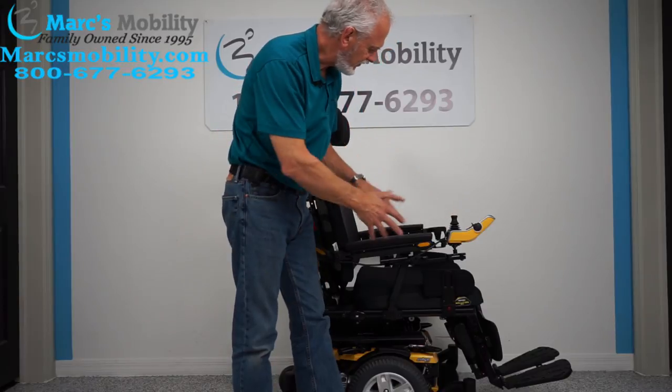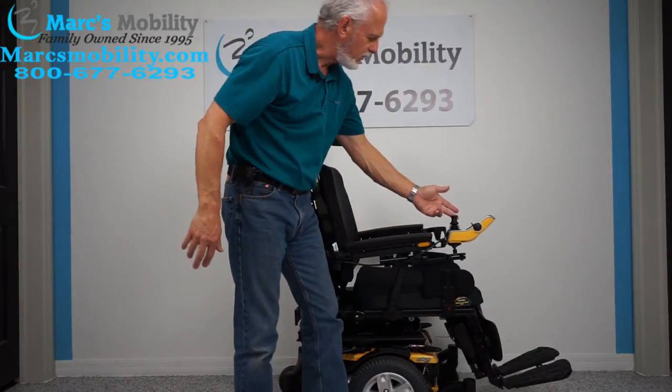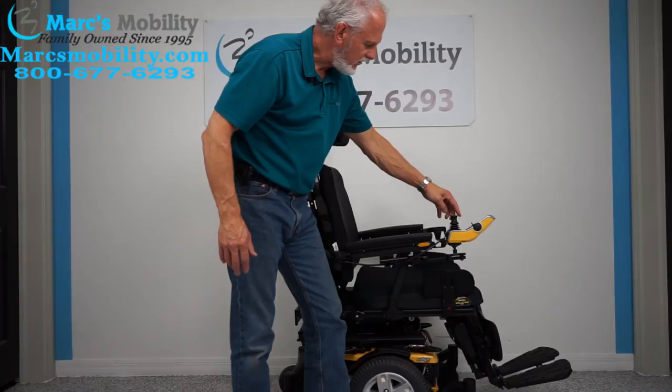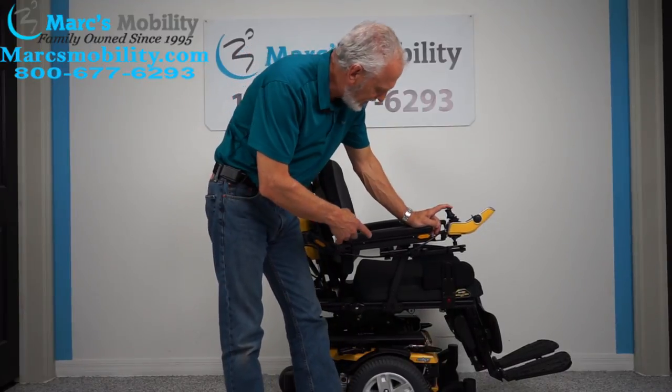Whatever is yellow on your seat is what the function is going to be working. Right now with the bottom and the back yellow, that would be tilt — but I'm going to move it sideways until I get the bottom of the seat yellow by itself. Once that portion is yellow, pull the joystick back, and here goes your seat lift.